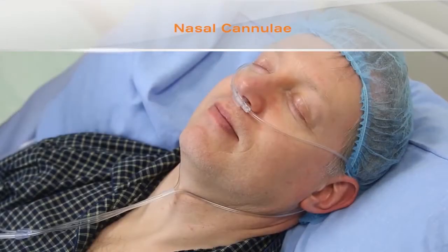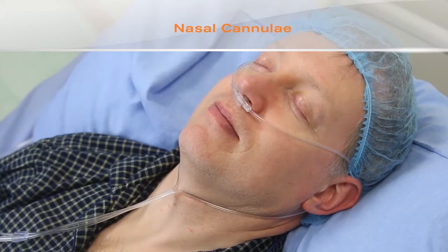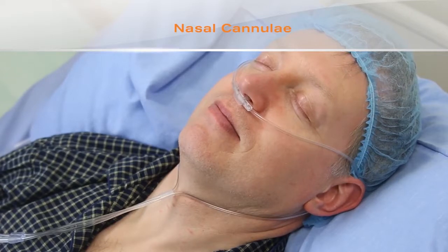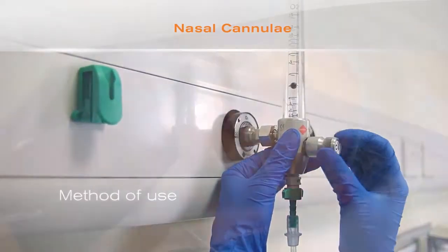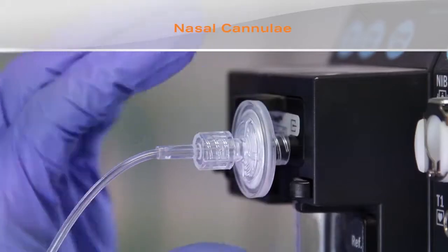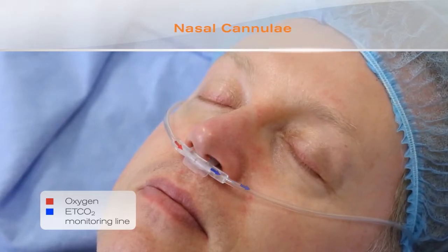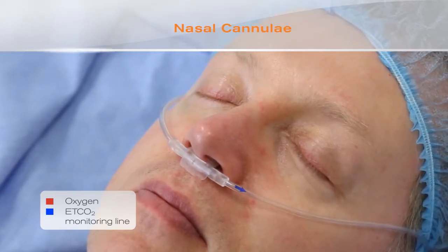Nasal cannulae are also available which allow sampling of exhaled carbon dioxide in non-intubated patients, and the Intersurgical devices with this feature are called Sentry nasal cannulae. These devices are suitable for patients undergoing conscious sedation where respiratory depression needs to be monitored. The Sentry nasal cannula is fitted to the patient in the same manner as a conventional nasal cannula. A monitoring line is then attached and connected to the capnograph. The Sentry nasal cannula allows delivery of oxygen through one nasal prong and the sampling of exhaled gas through the other prong. The end-tidal CO2 values are comparable to those achieved with intubated patients.